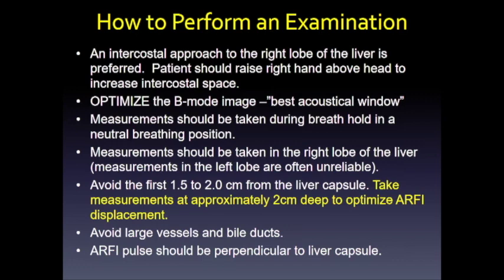We like to take measurements about 2 centimeters deep to the liver capsule. Going deeper causes greater attenuation of the ARFI pulse, resulting in weaker shear waves and more error in measurements. The optimal depth is around 4 centimeters from the transducer, where all probes are focused for best performance. In patients with a lot of subcutaneous fat, everything works against you, and it becomes very difficult to obtain good exams.